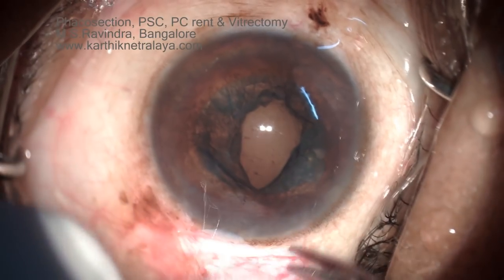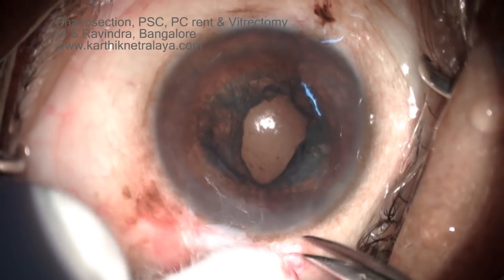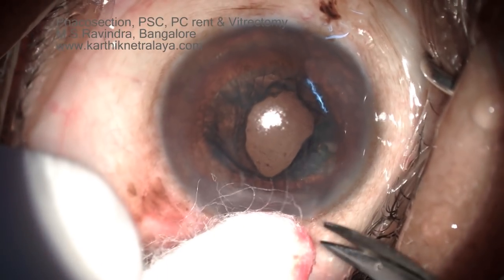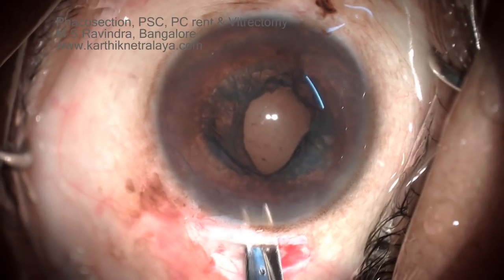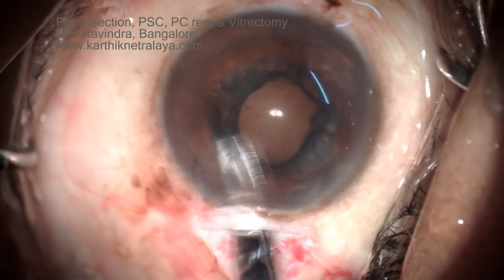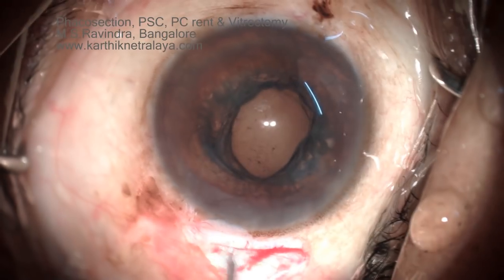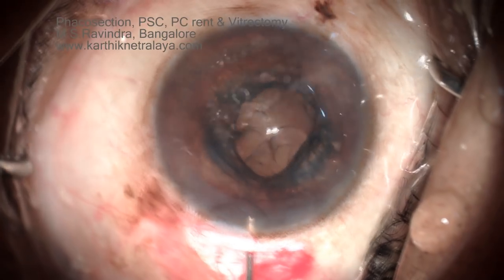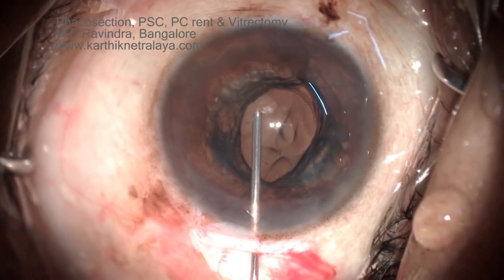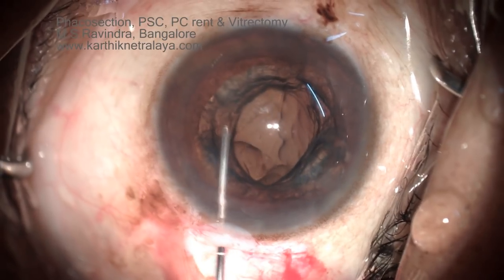There are a couple of options. A vitrector could be used right at this stage to cut the vitreous, but past experience has shown that cortical chunks can fall into the vitreous cavity. Instead, a combined approach using both vanase and vitrector is chosen. A vanase vitrectomy is performed first, with no drag on the vitreous, cutting the vitreous wherever it is present.